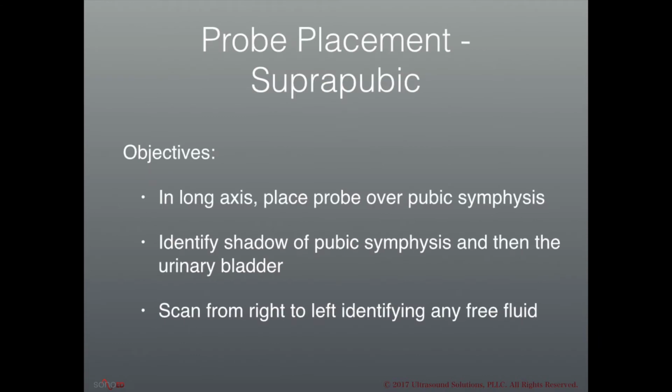Let's move on now to the second view I'd like to obtain, which is what I refer to as the suprapubic view. You'll also hear this view referred to as the pelvic view or the bladder view or the retrovesicular view. However, I prefer suprapubic view because it refers to where we're placing the ultrasound probe. I prefer to obtain this view in the long axis or sagittal plane with the inferior aspect of the probe placed over the pubic symphysis.